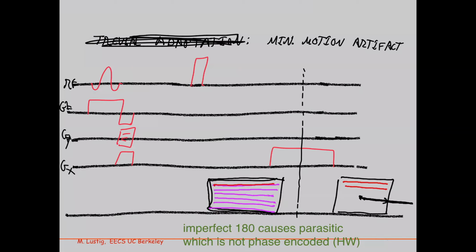Projection. Well, something is constant, right? It's not changing in the Y direction. So when you take a Fourier transform, in the Y-axis it cannot spread out, because it has no change. So in the Y-axis, it's just going to concentrate in the center. So the image that you get from this is an image of the brain with, well, I'm not using the right colors.